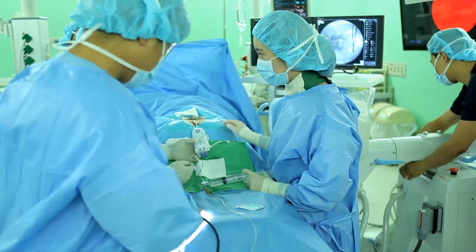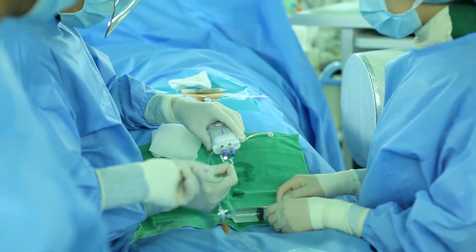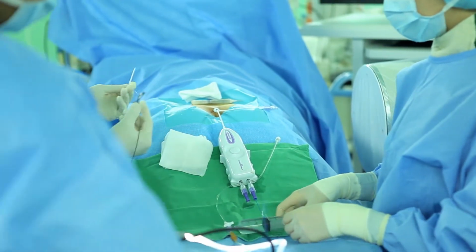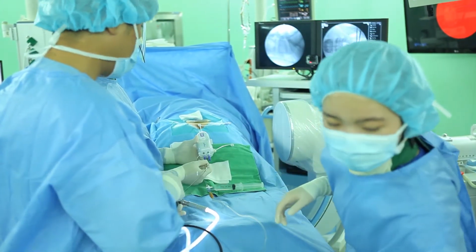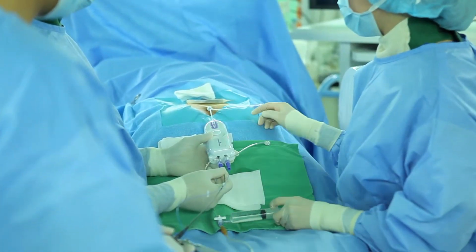You take out the endoscopic cable. Then, clear the cable tip with the wet gauze or check any substance of the connection part of the endoscopic cable. The purpose for the saline injection is to secure the way for the catheter advancement and to have the clear vision around the endoscopic cable.